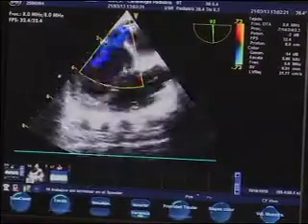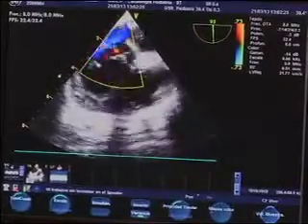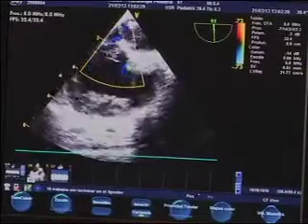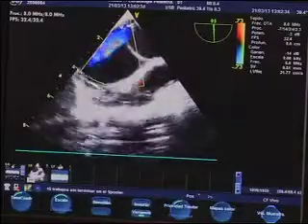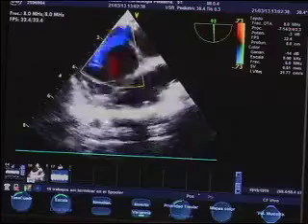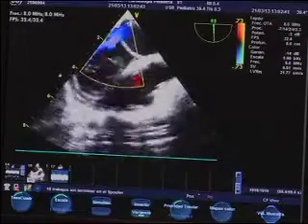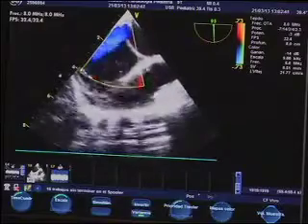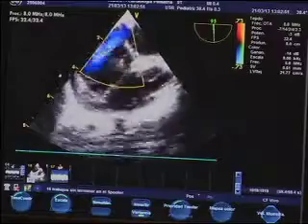That would seem to be the best approach, to try and see if you could puncture whatever septum's left there and then dilate that, and that probably would be enough without even needing a stent. If you get a separate puncture, you can actually create a circuit from one ASD to another. And if you use something like a coronary wire, you can easily make a cut through, and that will give you a very good opening. Okay, I think this is another option.